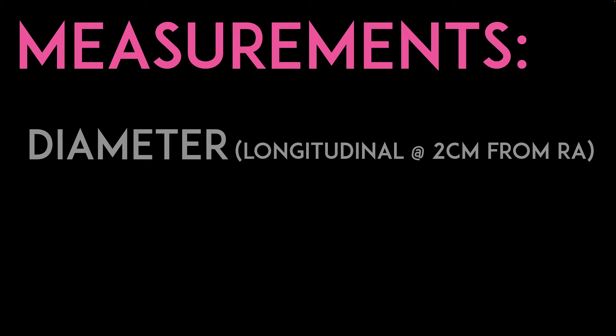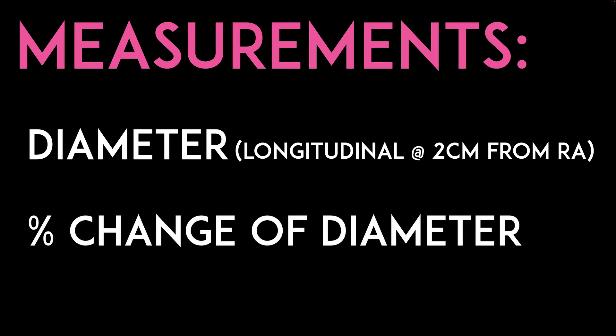We can just eyeball this, but if you want actual measurements, you need to measure the diameter in a longitudinal axis at about two centimeters from the right atrial junction and calculate the percent change.